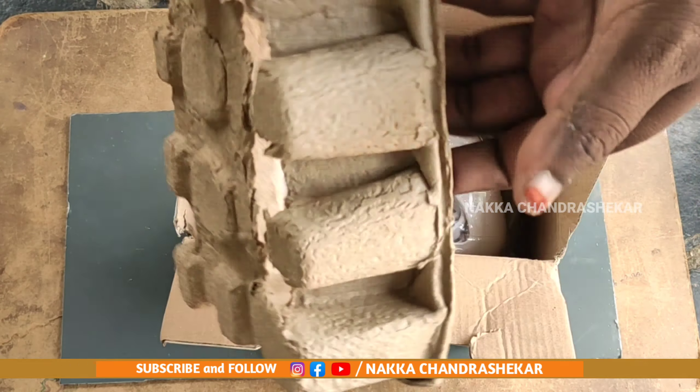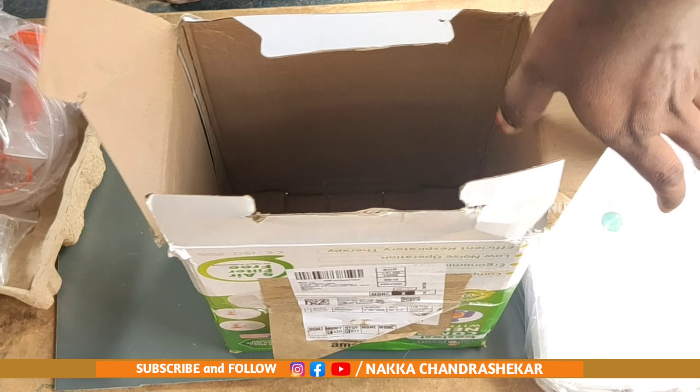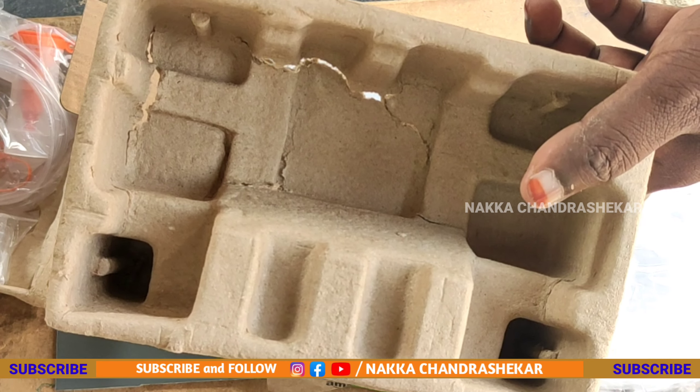I want to open my nose and see the filter paper and use it. Now you are going to see here — this is directly from the front. The front is open.